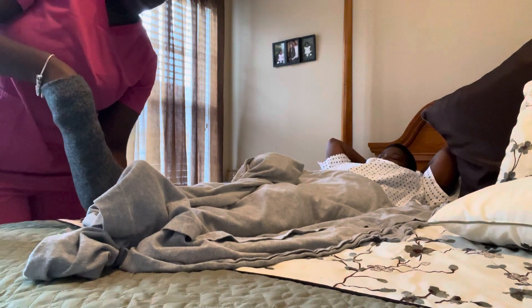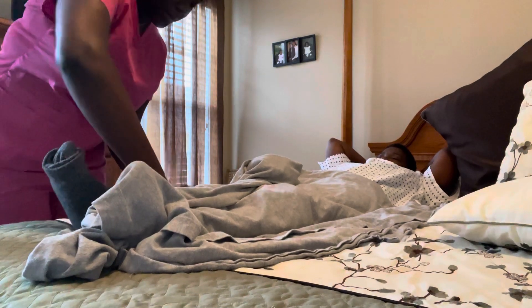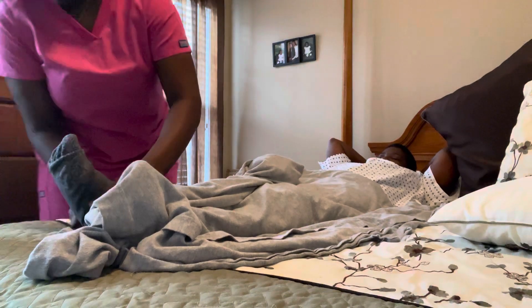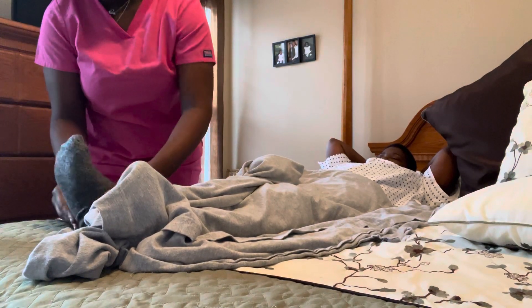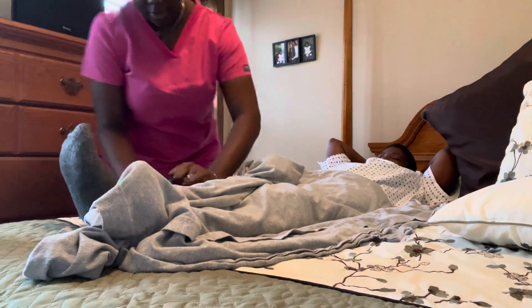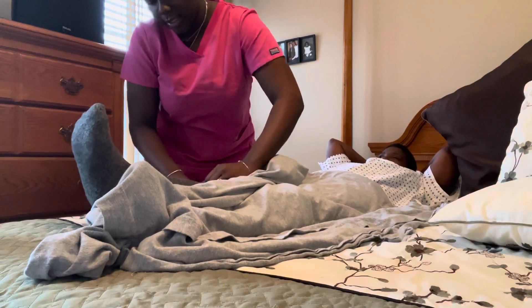And then place it on the patient's foot and leg, making sure to support the foot and not to overextend the patient's leg. I'm going to pull the stocking all the way up to the knee and adjust it so that the open part is above the toes. Making sure that there are no wrinkles or creases.